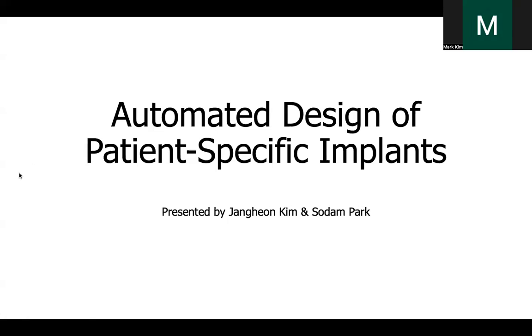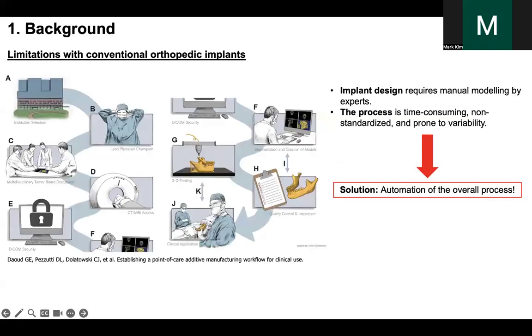Today, I will talk about the automated design of patient-specific implants. Firstly, I would like to talk about the background of this project.